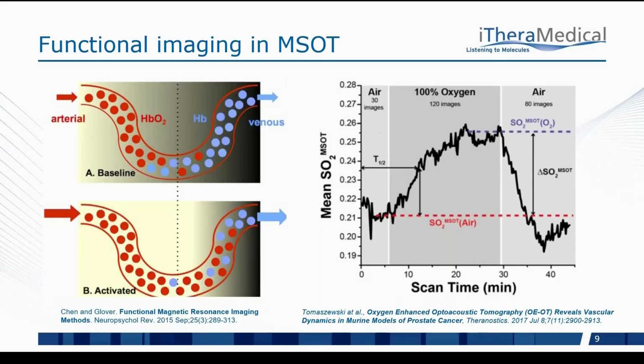In terms of functional imaging, this phenomenon is probably well known to this audience, so I won't spend too much time introducing it, except to say that through arteries, veins, arterioles, venules, and bulk tissue, hemoglobin is transporting oxygen throughout the body. As oxygen is needed, then these oxygen molecules will come off of hemoglobin, and then the hemoglobin will become less oxygenated. And the reason we can detect that is that, as I showed 2 slides ago, the oxy and deoxyhemoglobin have distinctive spectra. So just as would be done in BOLD with the sensitivity for deoxyhemoglobin, we can detect not only HbO2, but also Hb, and that allows us to see not only these chromophores, but calculate oxygen saturation, total hemoglobin, and present that either as an image or a quantified value.